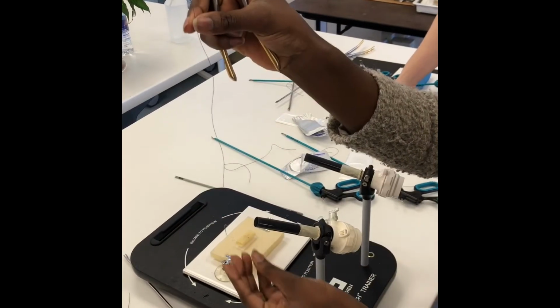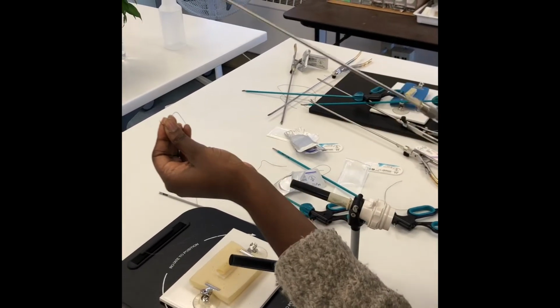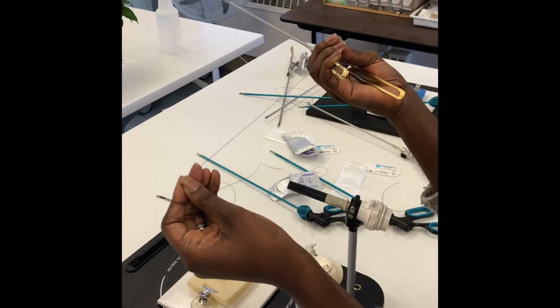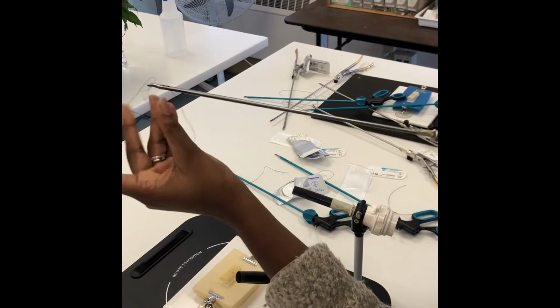Second thing is I load my needle the way that I want it to go inside the body. So I'm right-handed. I put the tip to the left. This is how I want to load the needle, and so that's how I'm going to introduce it. I also bring the tail in with it so that I don't have to drag the tail after it gets into the body. So like this.